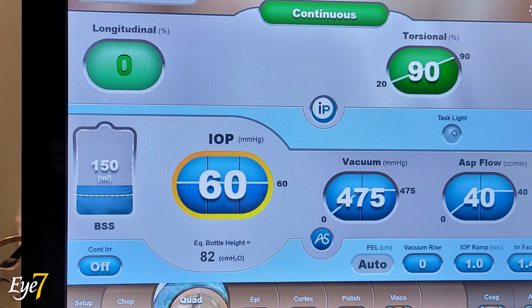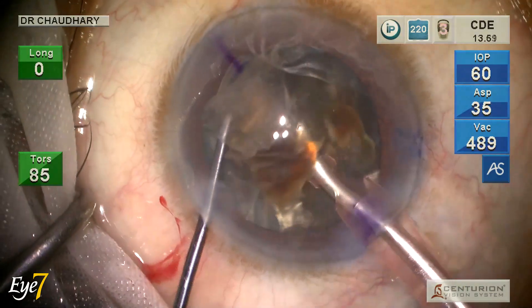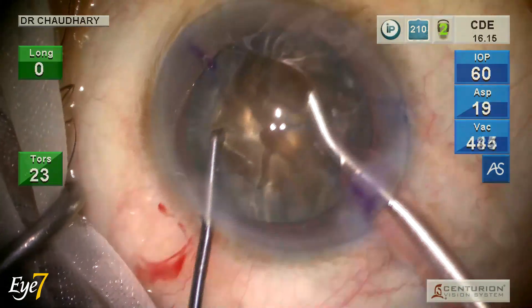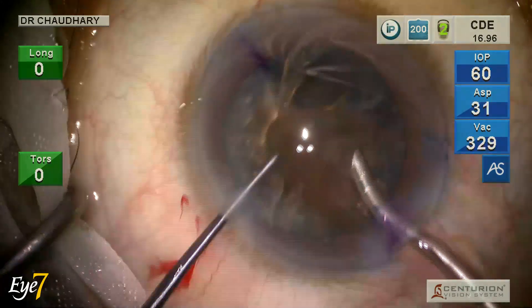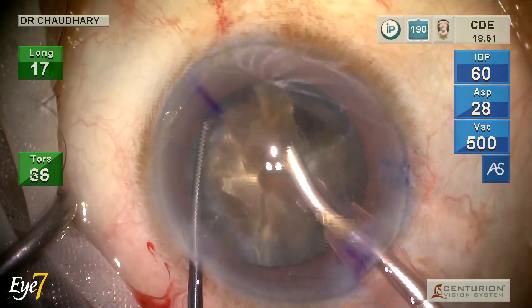These are the parameters for quadrant removal — now only in torsional phaco mode with no longitudinal phaco. The IP now kicks in: when the tip gets occluded, it pushes the nuclear piece away with a longitudinal stroke so it moves around and comes back to the phaco tip, making emulsification easier. I hold each piece, bring it to the center in the pupillary plane, then in foot pedal 3 emulsification begins.